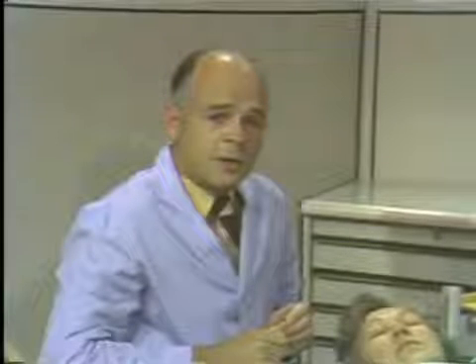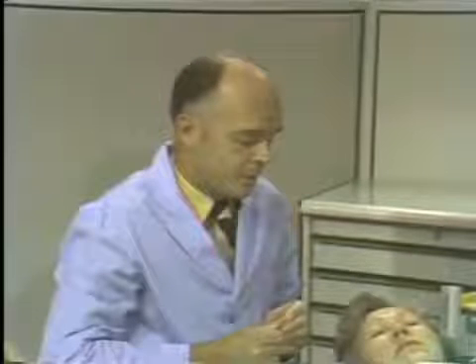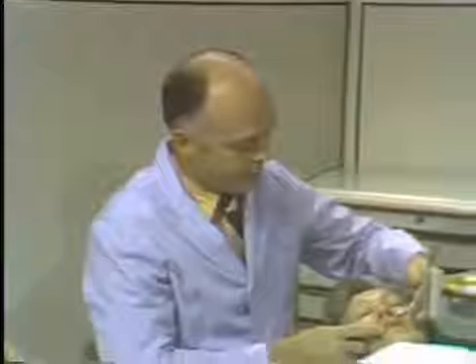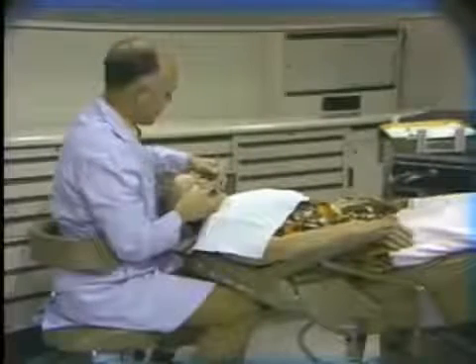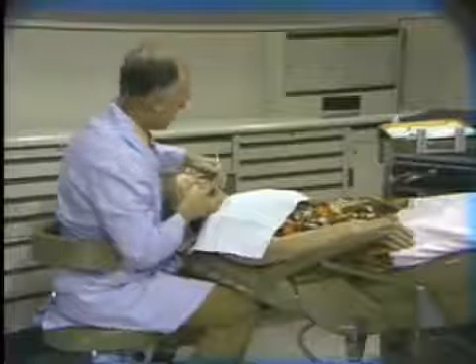You will have to stop and rinse your mirror quite often. You should reduce the volume of water in your high-speed handpiece and perhaps use a surface tension reducing agent on the mirror to help maintain a film of water on the mirror. But taking those precautions, most of your work will be done relatively easy with the use of the mirror in the maxillary arch.